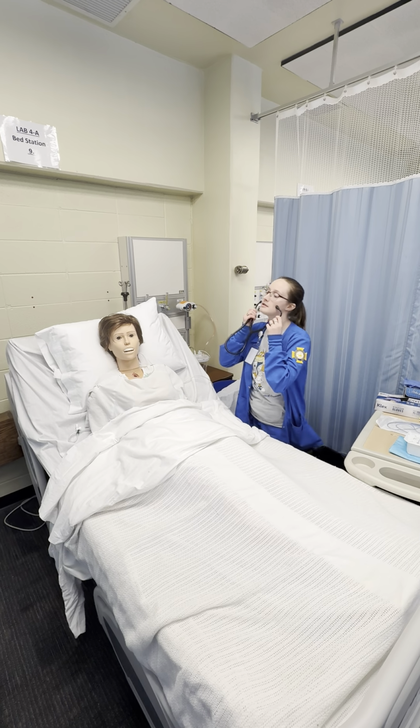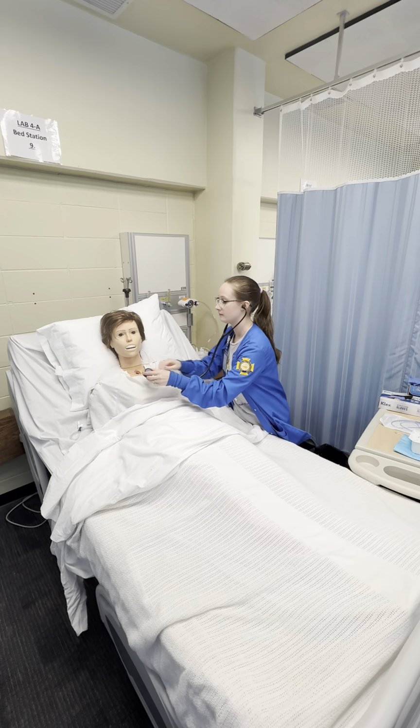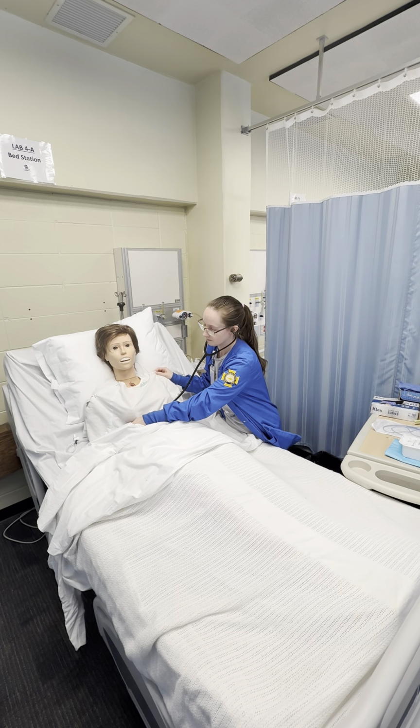Hi, my name is Caitlin. Today I'm going to be demonstrating how to insert a nasogastric tube. First things first, I'm going to do my general principles and safety practices. I'm going to do my 11 medication rights of administration if needed.